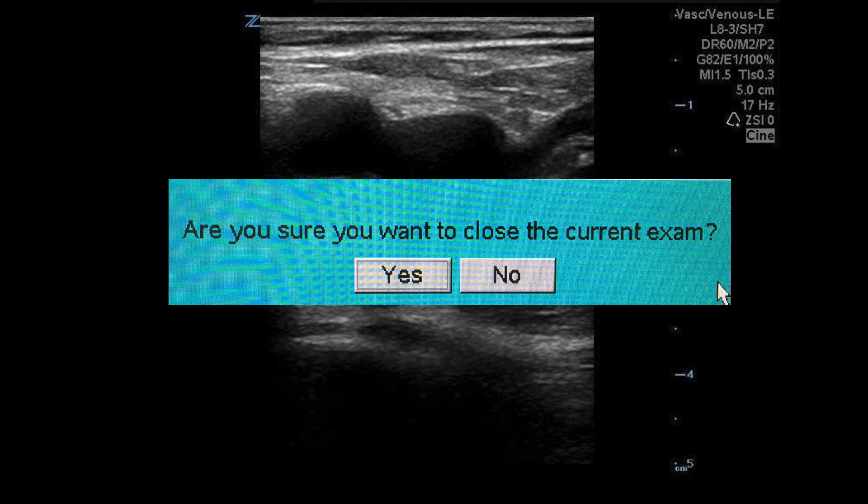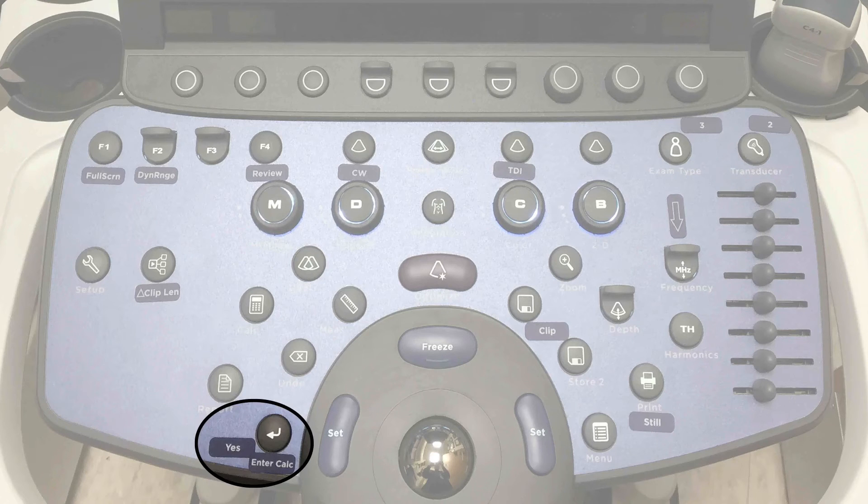Click on the yes button using your trackball and your set key. Alternatively, the yes option is already defaulted, so you can simply press the enter button rather than having to use the trackball and the set key.